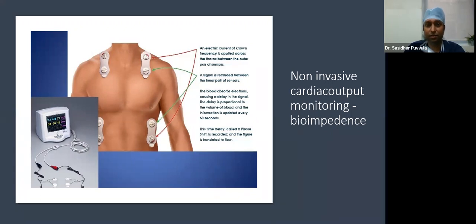And I also discussed the PA catheter, its positioning, and the indicators in the PA catheter that we utilize clinically. And I discussed briefly cardiac output monitoring, the types of cardiac output monitoring, and the invasive, non-invasive, and minimally invasive methods. So with this, I conclude my talk, and I will be going into the MCQs.